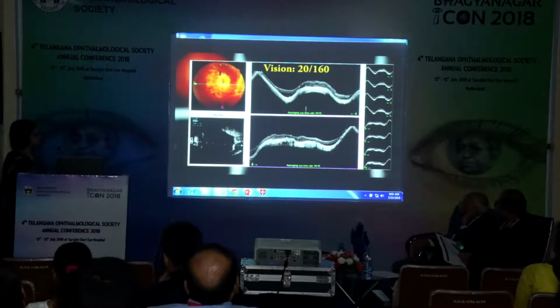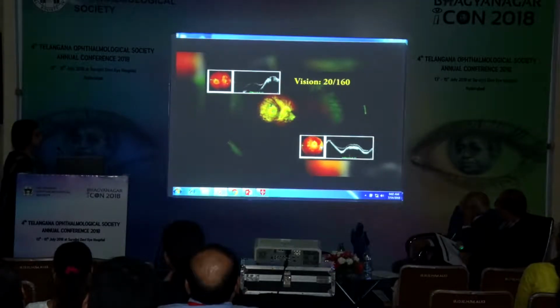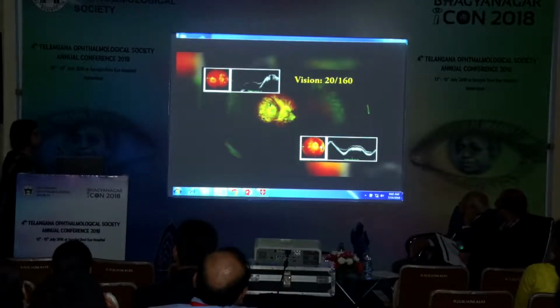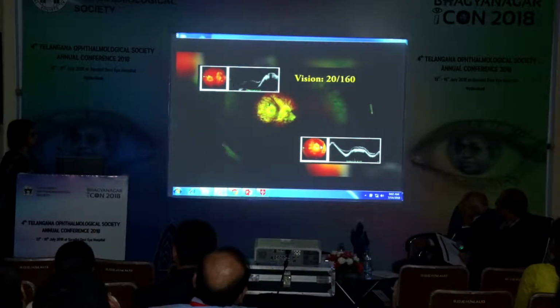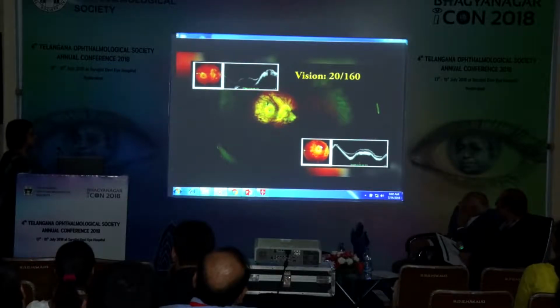Macular buckle surgery counters the pulling effect of the posterior staphyloma and restores the functional vision in highly myopic patients, provides good anatomical and functional outcome, and solves the mystery behind the treatment of such detachments.